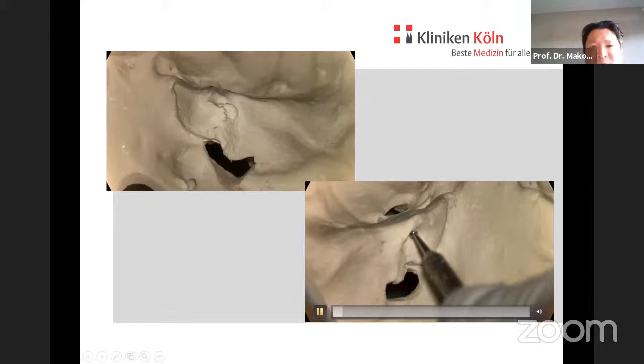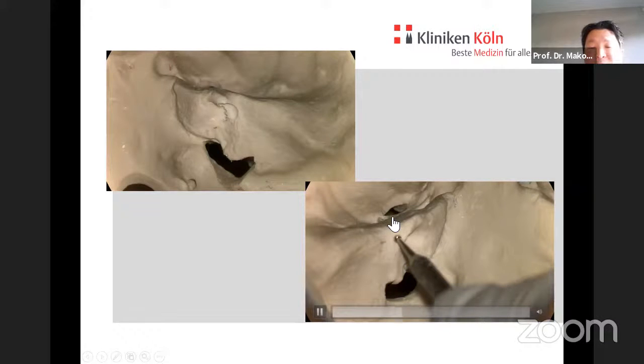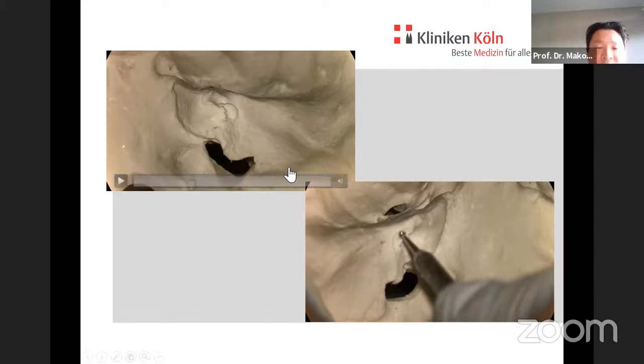When you do this, you don't get in trouble with slipping away or getting in from medial with the drill and coming into contact with the facial nerve or the cochlear nerve. On the opposite, on the left side, you of course do the opposite. You put the pressure more in the direction of the petrous bone and then do a round movement. So I do a clockwise movement in order to open the internal auditory canal.